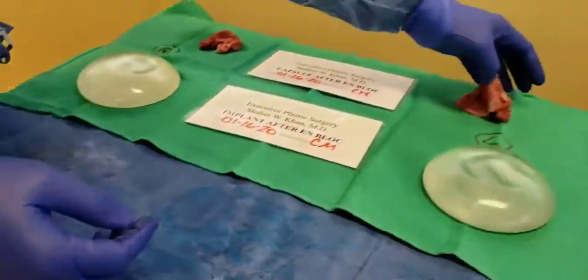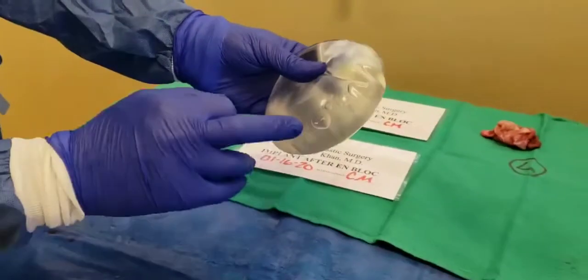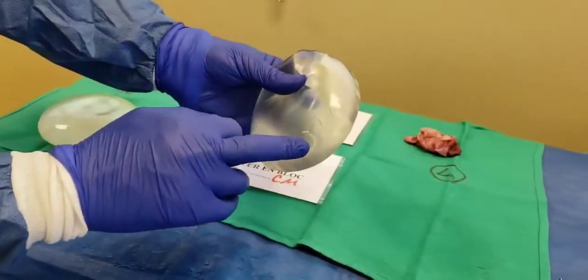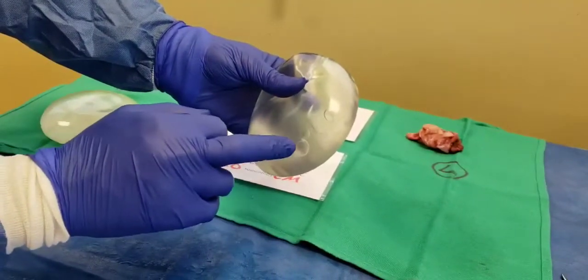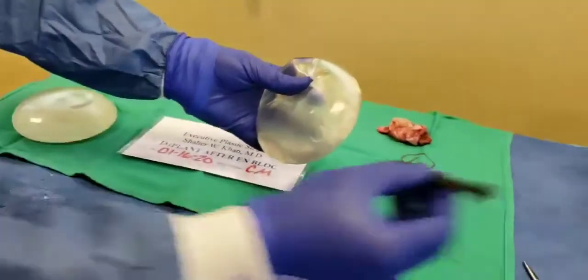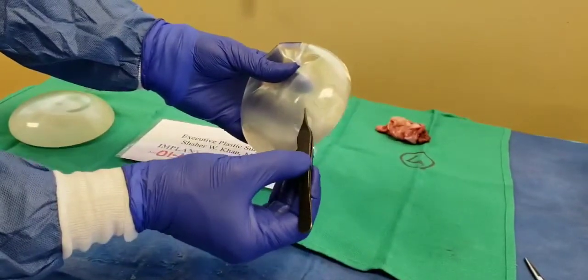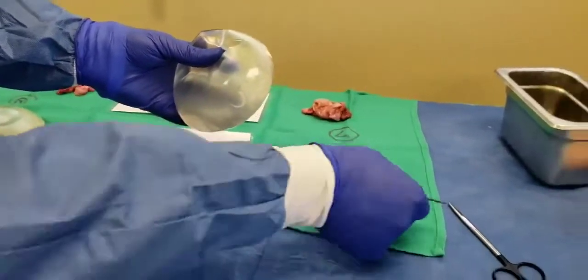Now to my surprise today, as you can see, some actual bubbles within the implant itself. You can make out air pockets, bubbles: one, two, three, four that I see.